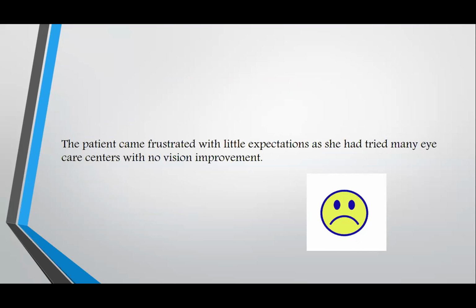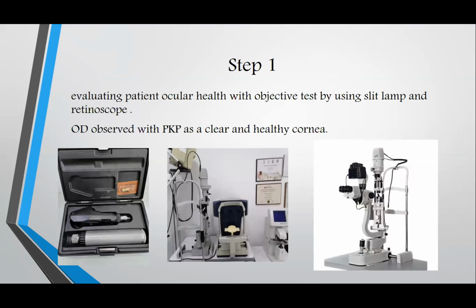We received the patient and told her that we have the latest generation of lens invention, and let us try a session so we can understand your case and achieve this visual correction with comfort. During my evaluation, I would like to emphasize that all eye care centers and optometrists should use their best devices to evaluate these cases, like the slit lamp, which is very important, and your ARK, retinoscope, and topography if you have.